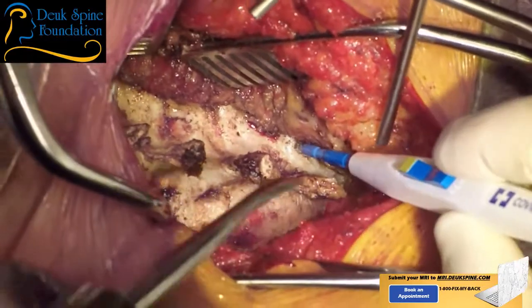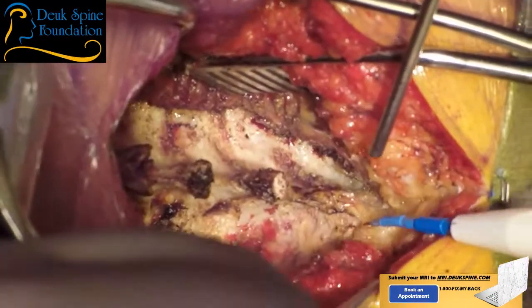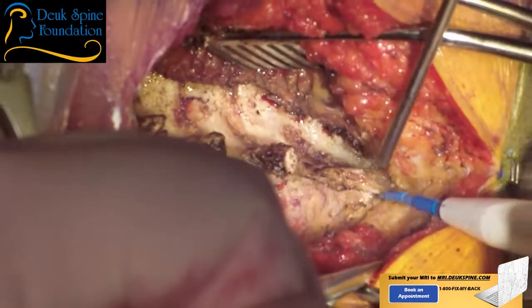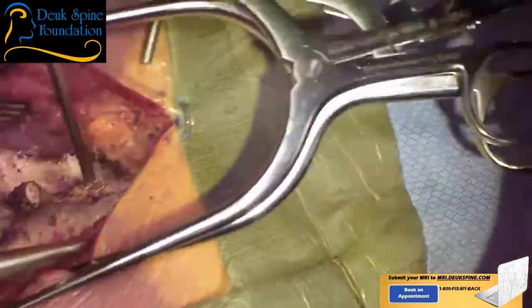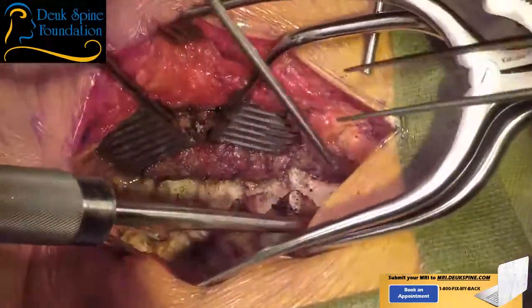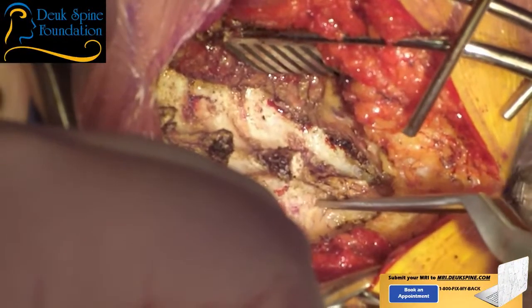We've got our T1 and T2 transverse processes exposed on Patel's side. Now I gotta come over to my side. I need the, yes, perfect, Luis. Luis, amazing, great job. Anticipation. You're welcome.